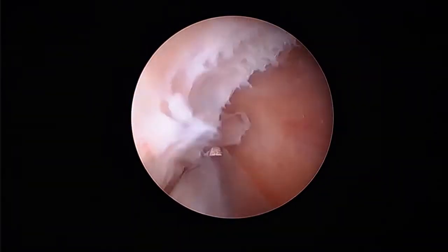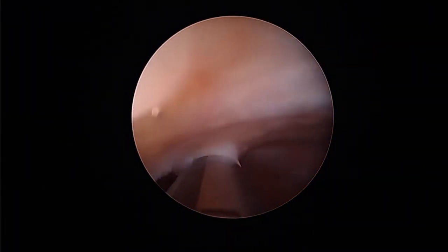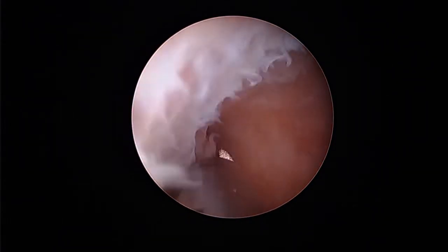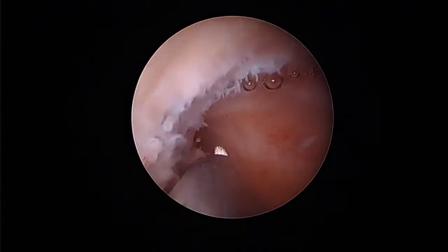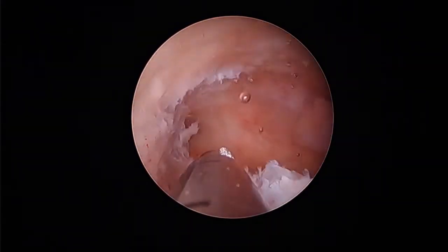Here the morcellator is reducing the tissue bulk of the polyp, and we see the tubal ostea at the tip of the morcellator.